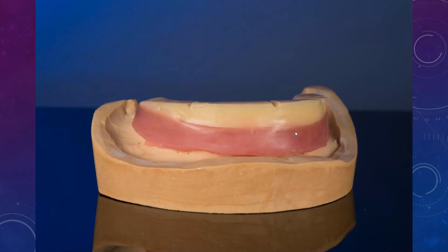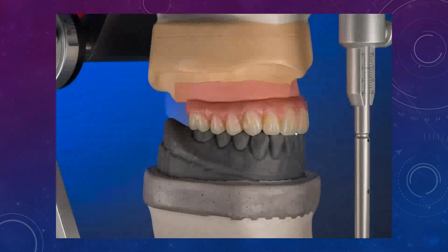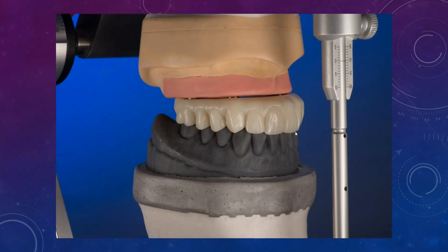So basically same thing, wax rim, the setup. And from here, guys, it depends how you're going to move forward. If you're doing a regular acrylic hybrid, you just need to take it to this step. If your patient is super, super picky and they want to change a lot of things, even with the regular acrylic hybrid, we've done this before, you want to do a prototype. But if you're doing a zirconia case down the line, which we do nowadays, you definitely want to have a prototype of some sort.